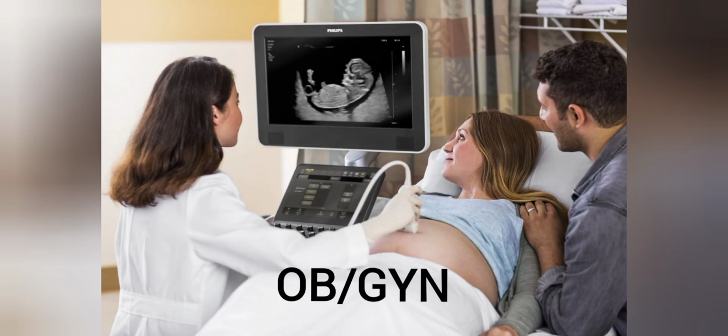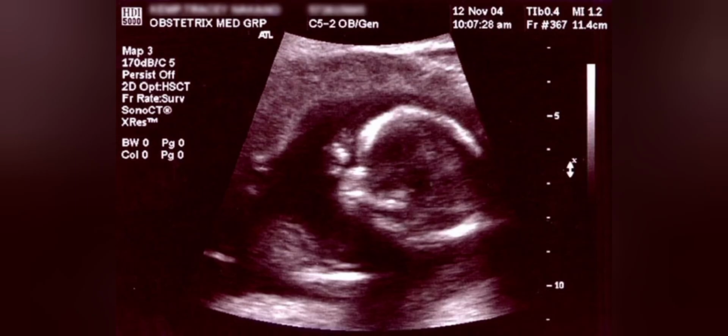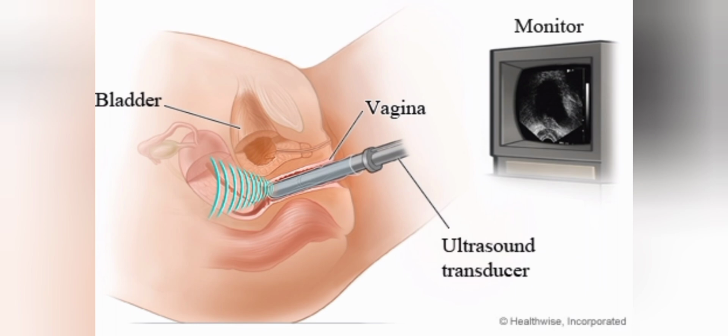Next type is OB/GYN ultrasound machine, which is also called as obstetrics and gynecology. Obstetrics ultrasound confirms pregnancy, determines gestational age, locates the placenta and also diagnoses fetal malformations. While gynecology ultrasounds perform imaging of female reproductive organs to assess their size and position, the thickness of tissue lining, and look for masses and abnormalities in female reproductive system. Endocavitary probe is used in this system. This probe is inserted from vaginal cavity and the examinations are done as shown in image.